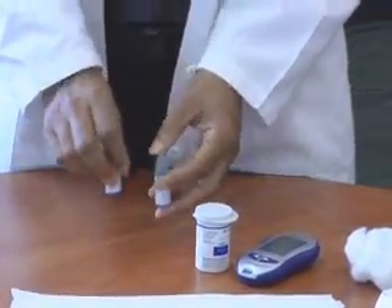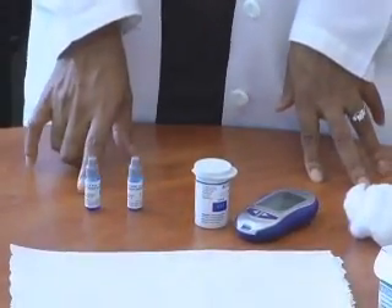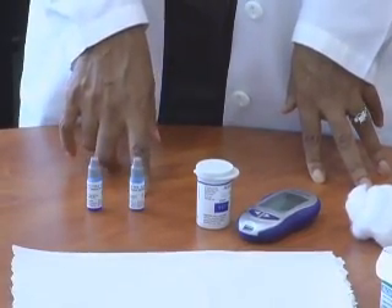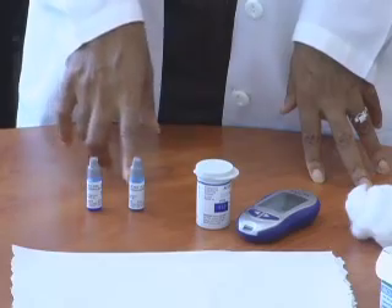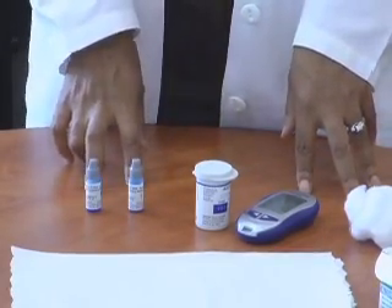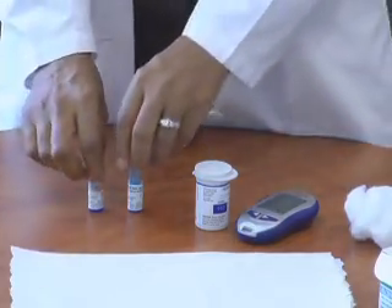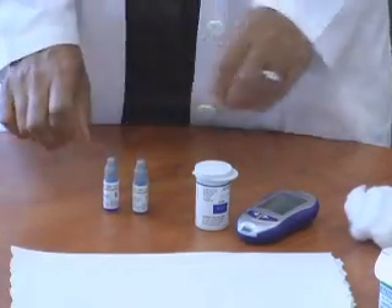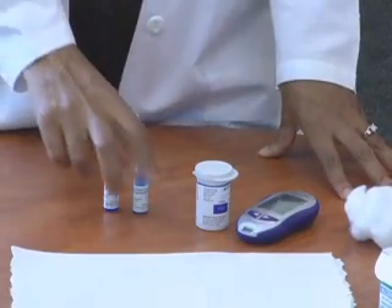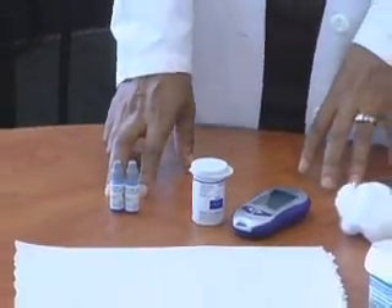Prior to beginning any glucose screening, you must run two levels of control. This is a requirement by the Department of Human Resources. In order to do blood glucose screenings, we have to make sure the meter is functioning properly. You need to have these control solutions. Typically, you will not be able to find these control solutions at a pharmacy or drugstore — we usually order them off the internet. They cost about $10 for the two of them, so make sure you have those when doing your blood glucose screenings.